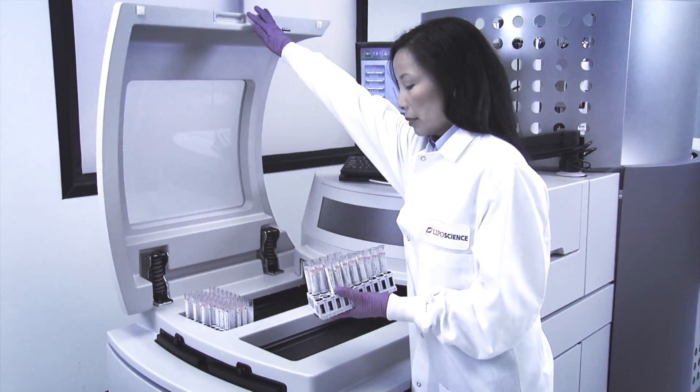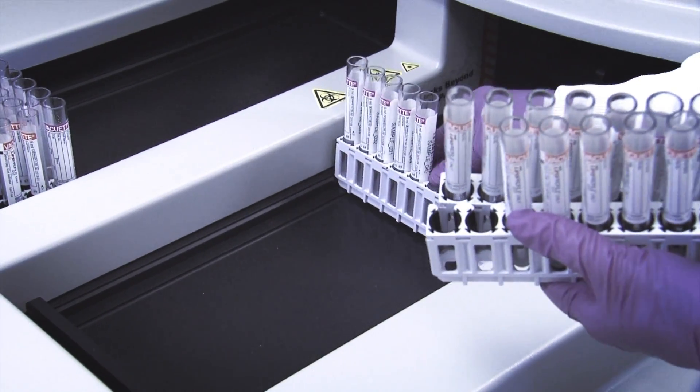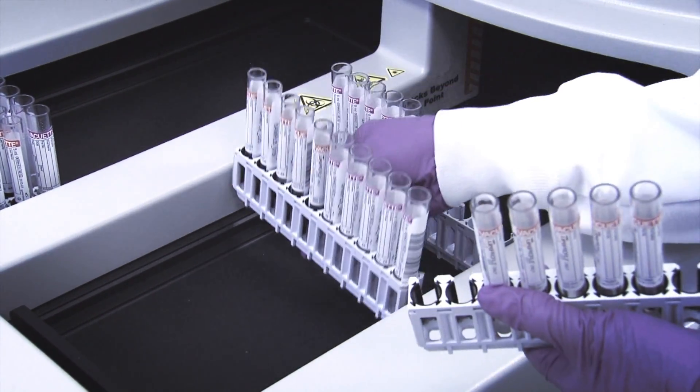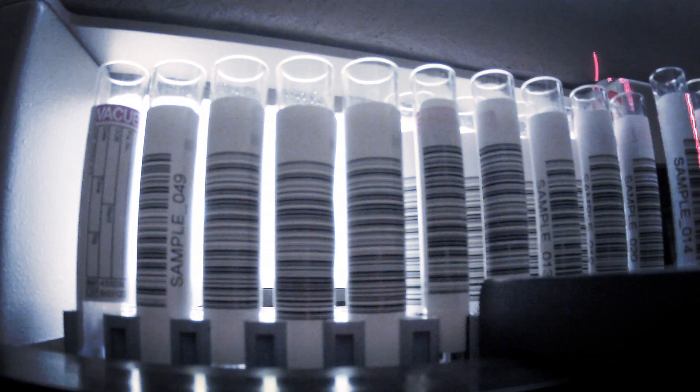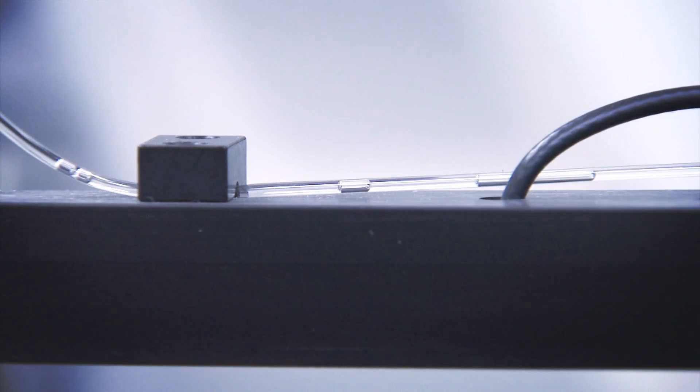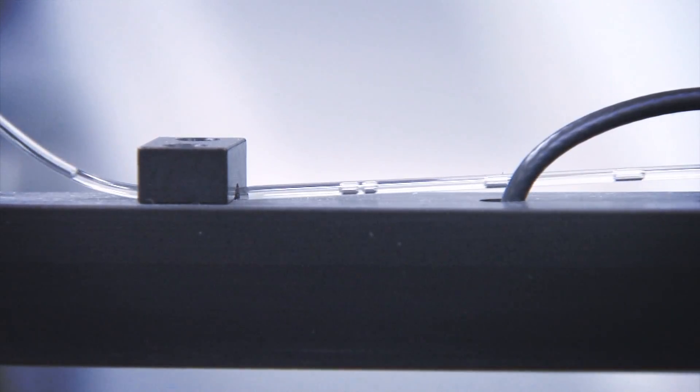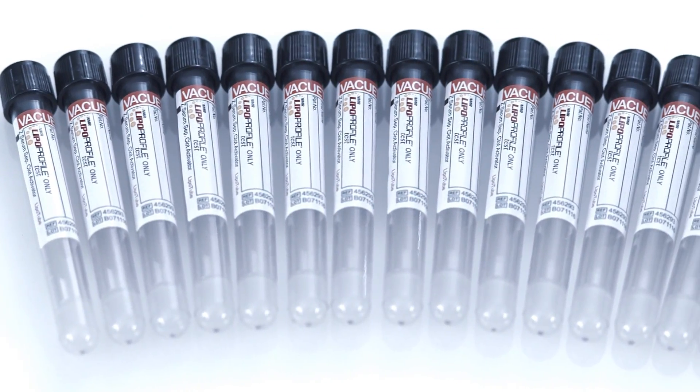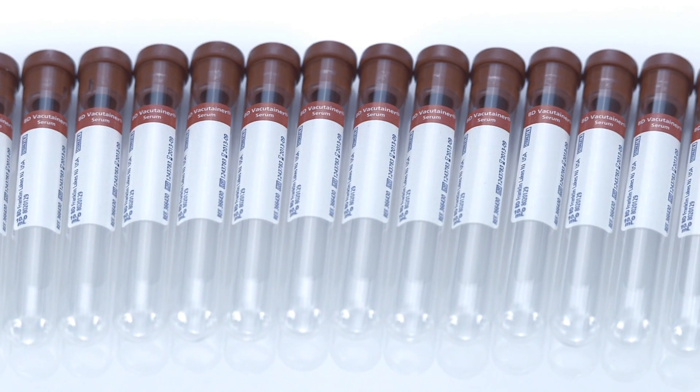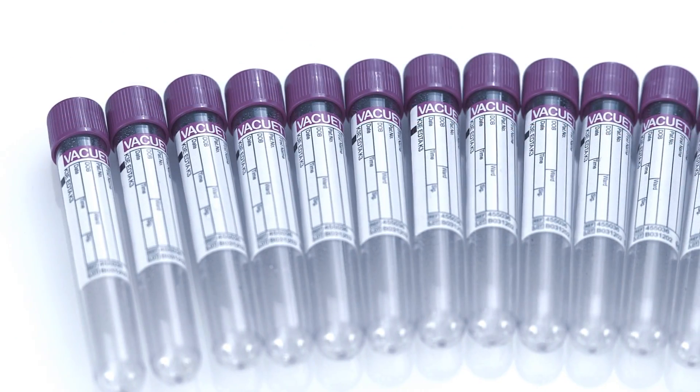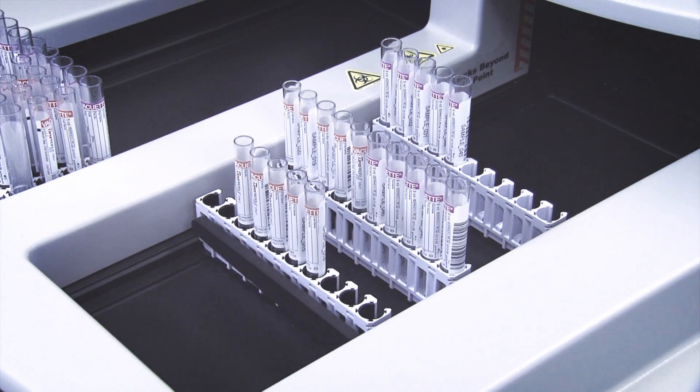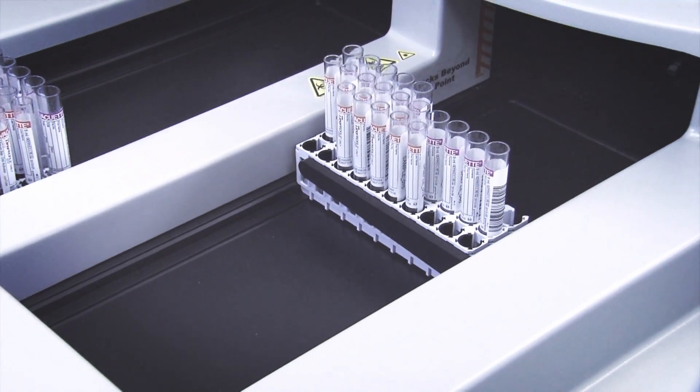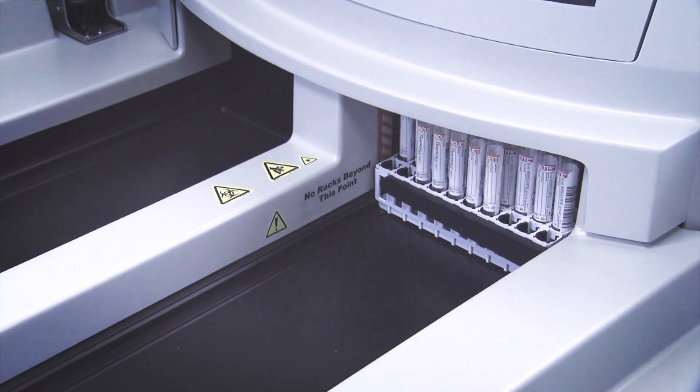Bar-coded specimen tubes can be placed directly onto the system maintaining positive specimen identification throughout the process. The direct tube sampler has been designed to process serum or plasma specimens directly from NMR lipoprofile test tubes, standard red top tubes or standard lavender top tubes. Continuous access of up to 200 patient specimens allows you to maximize walk-away time and throughput efficiencies.